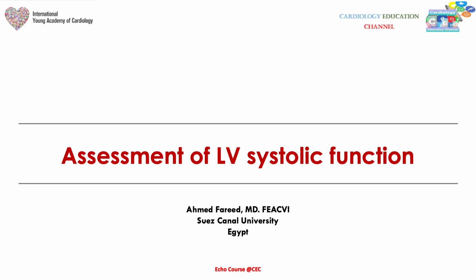Hello everyone. My talk today will be about assessment of the LV systolic function using basic echocardiography.